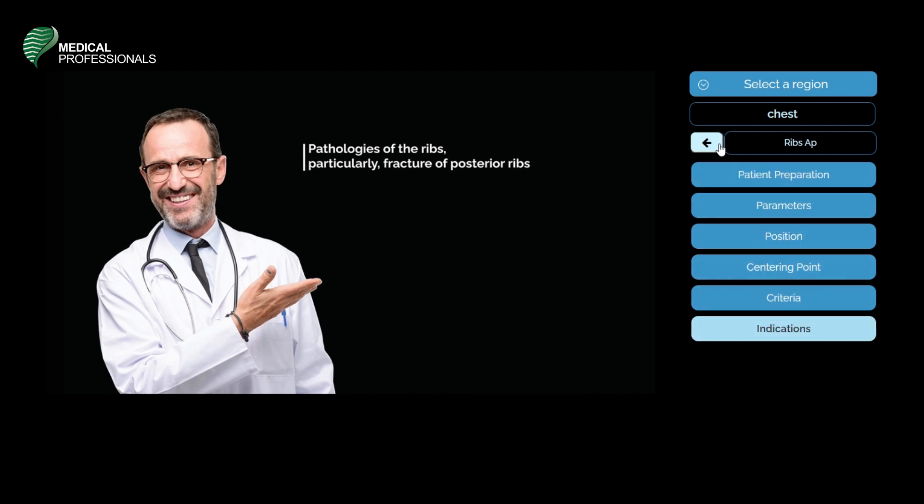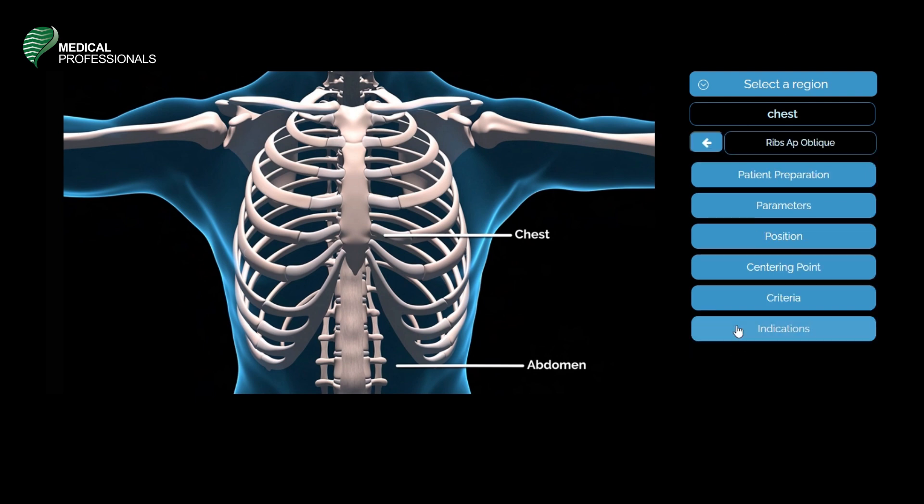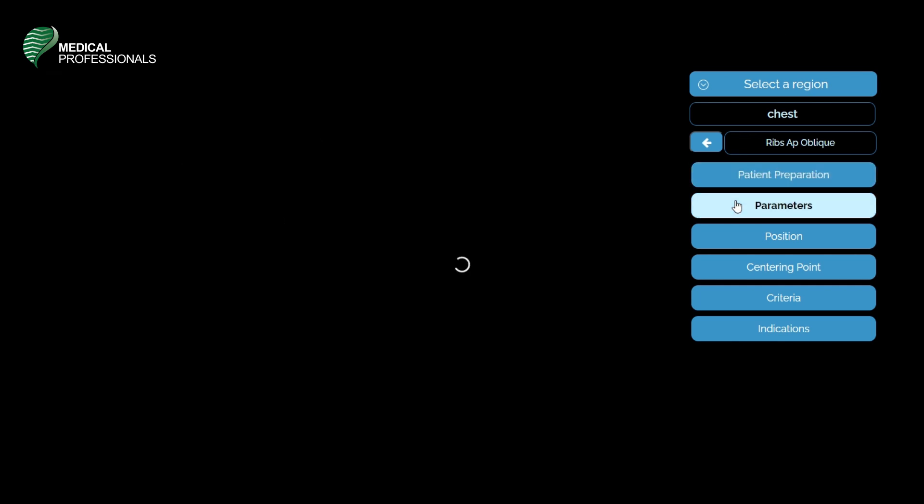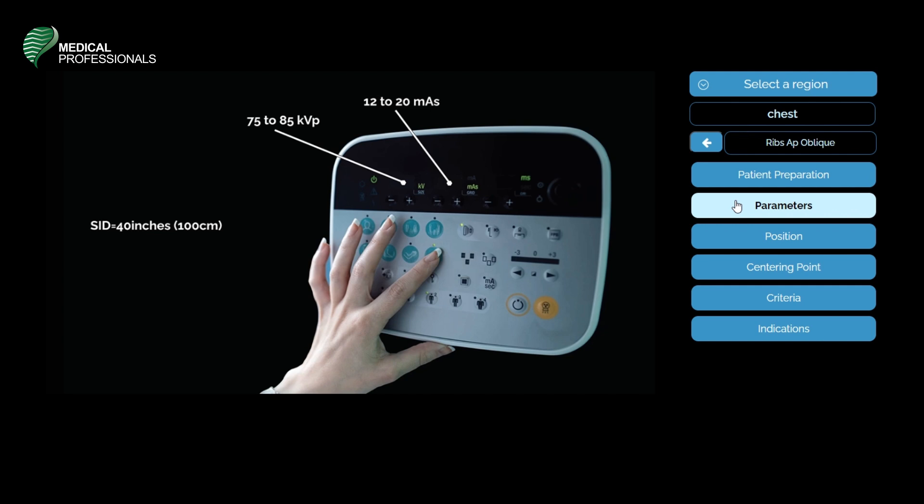The final position is an oblique AP of the ribs. Patient preparation includes checking identity, removing metal objects, verifying the request, explaining the procedure, and checking for pregnancy. Radio protection includes gonad shielding and tighter collimation. The parameters are 75 to 85 kVp, 12 to 20 mAs, and a source image receptor distance of 40 inches or 100 centimeters.